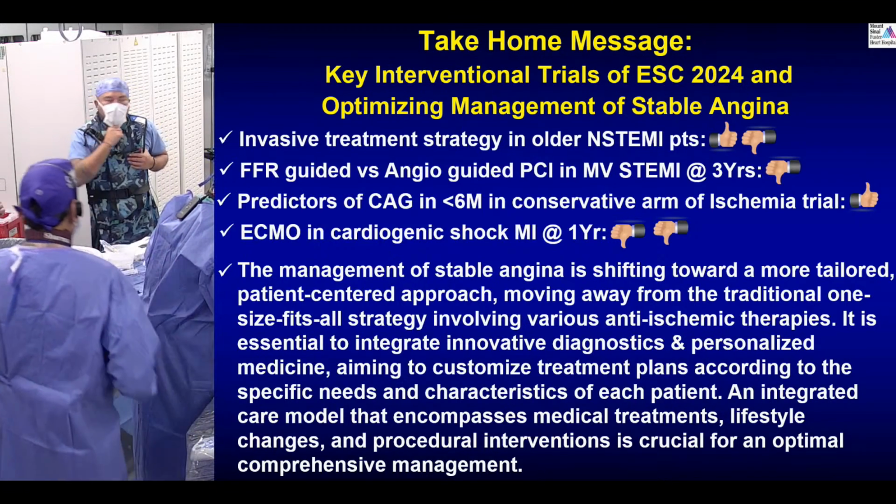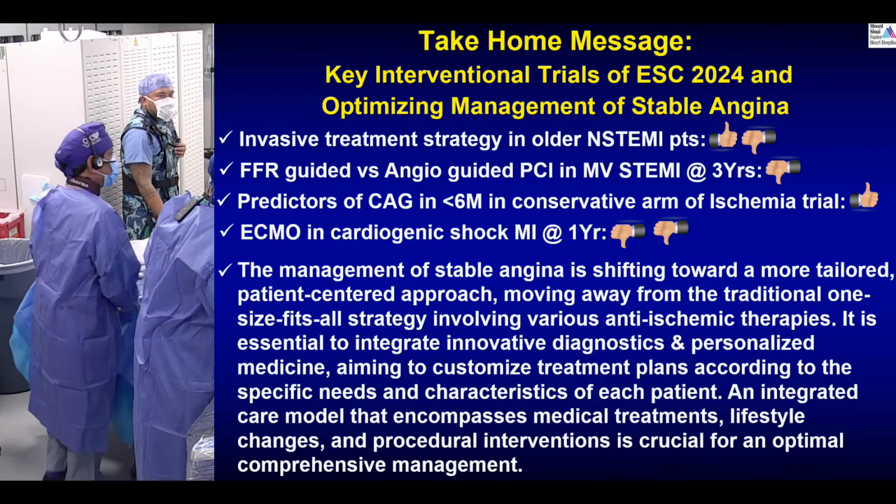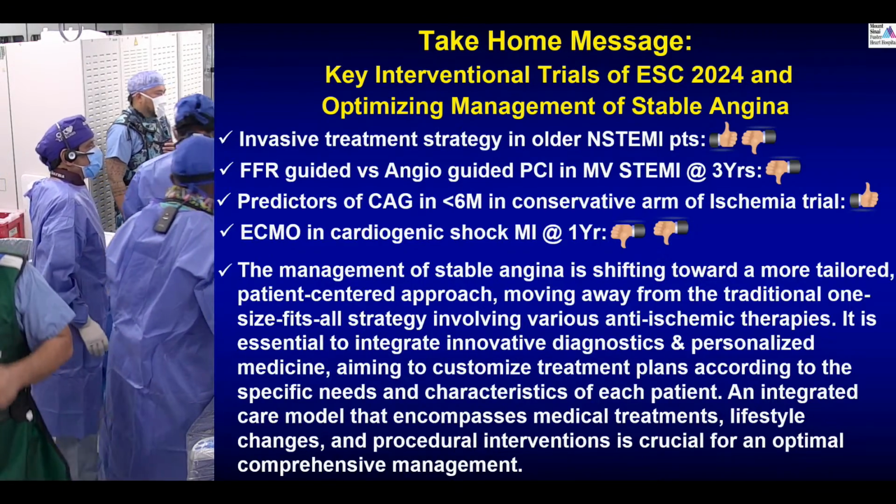With that note, I think Anu is about done with the things. Right? Give me that. So what do you have now? No, we were done. Go to the everything.